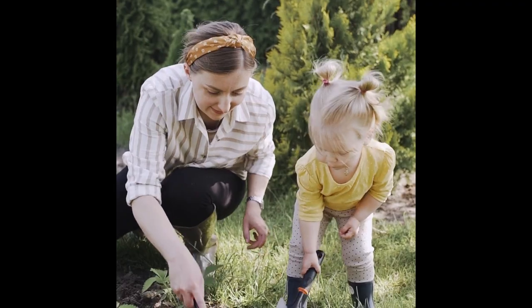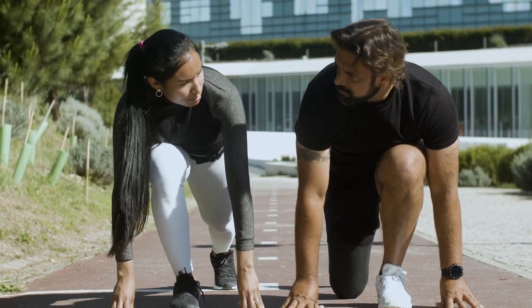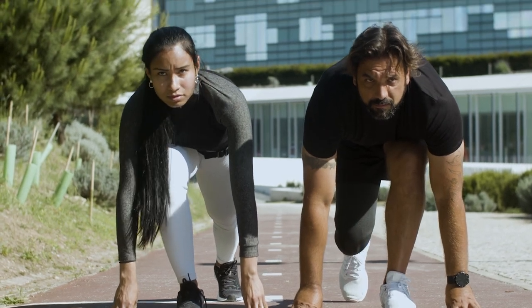How important is knee range of motion to you? Are you routinely doing activities that require you to crouch or excessively bend your knee? You just want to keep those things in mind because some of those activities are going to be a little bit trickier with sleeve suspension and restricted range of motion at the knee.